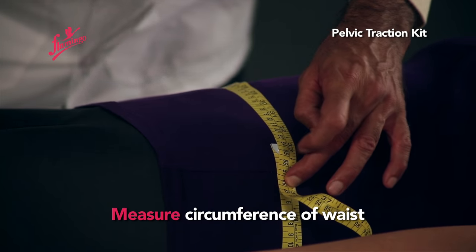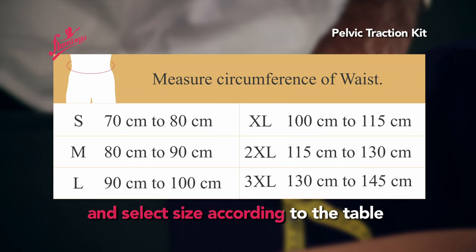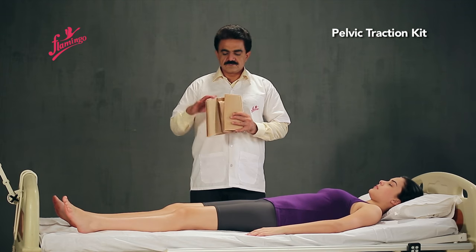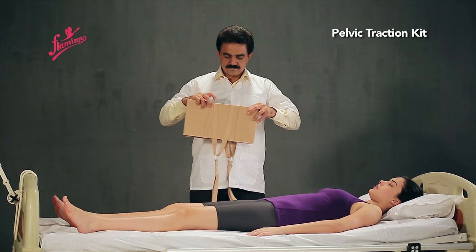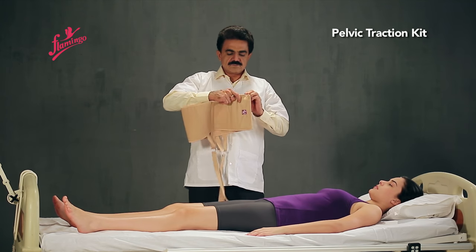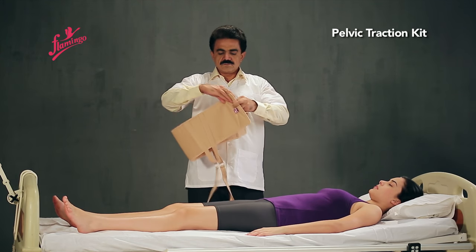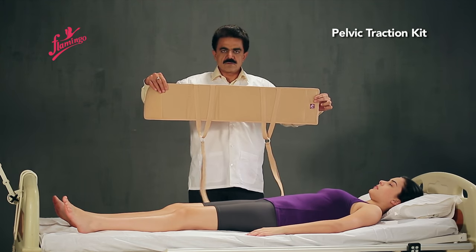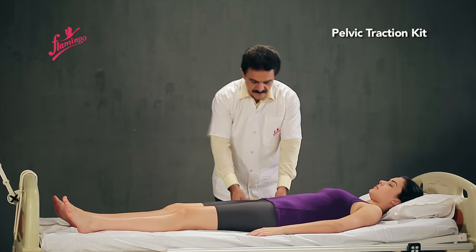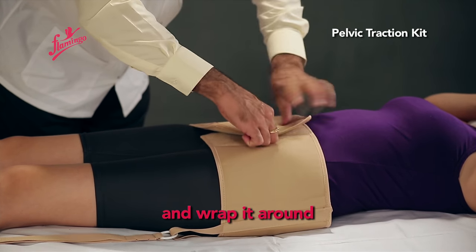Measure the circumference of the waist and select the appropriate size according to the sizing table. Place the Pelvic Belt below the waist and wrap it around.